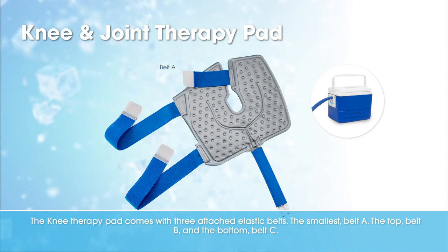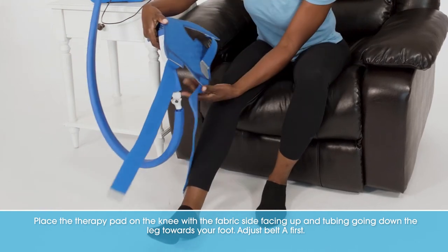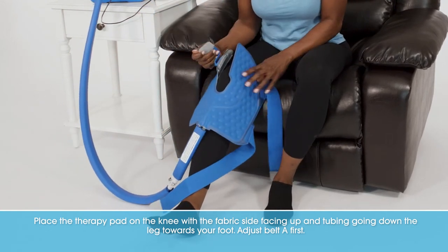The smallest belt A, the top belt B, and the bottom belt C. Place the therapy pad on the knee with the fabric side facing up and the tubing going down the leg towards your foot.